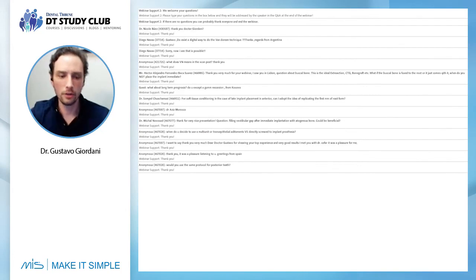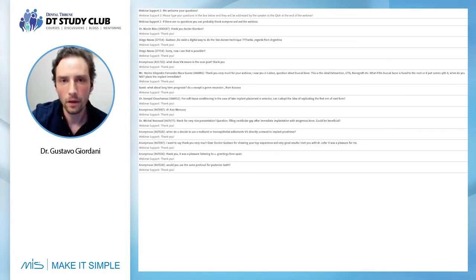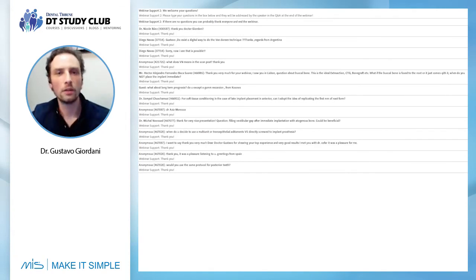We extract the tooth, we place the implant guided, we try to use the septum, we place the biomaterial, we use connective tissue graft, we scan the implant, we go to the software, we take the molar from the CBCT, and we make a customized healing abutment.